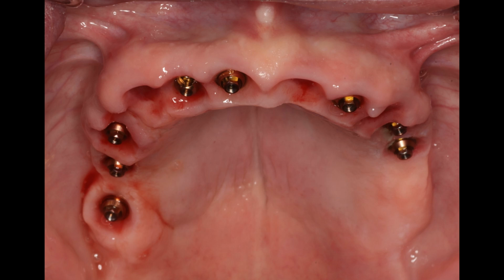And another thing I'll mention here is that I've gotten away from doing individual bridges. I now do one-piece bridges. That 3-on-6 concept that you may have researched or heard about, I did a lot of that in the past, but I found that if an implant fails, usually we can just take the implant out and put the whole bridge back in without any interruption in care. With the 3-on-6, if you lose one implant, you have to have more surgery.